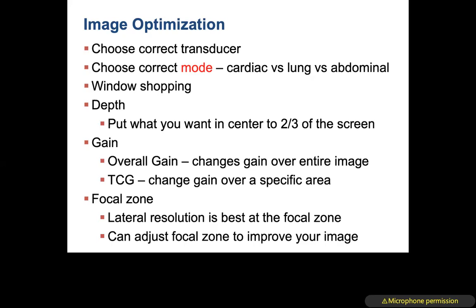We're always going to start with window shopping. So if you're looking at the heart, you're going around the chest trying to find that best window to look at the heart. Or if it's the kidney or whatever you're looking at. Depth, we want to make sure we optimize that depth. So put what you want in the center to 2/3 of the screen.